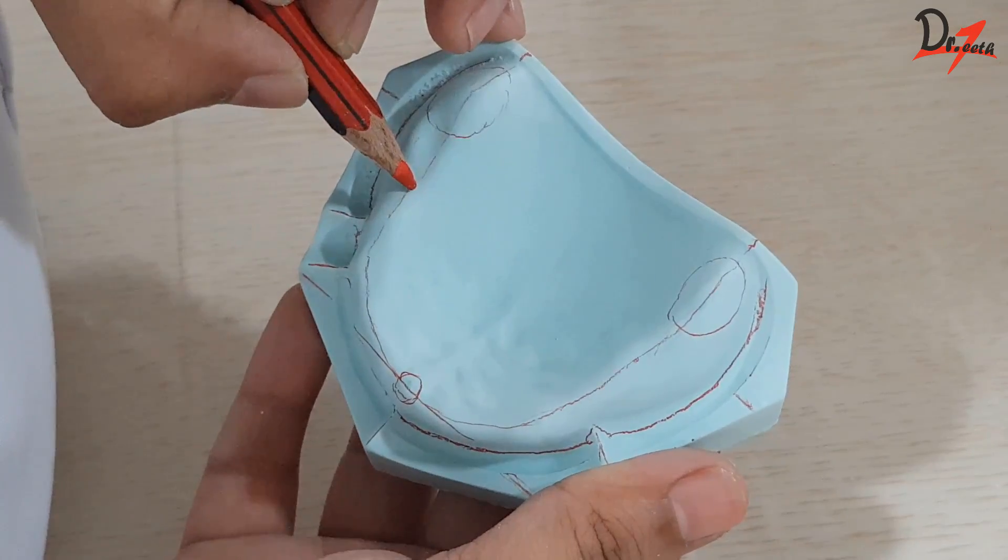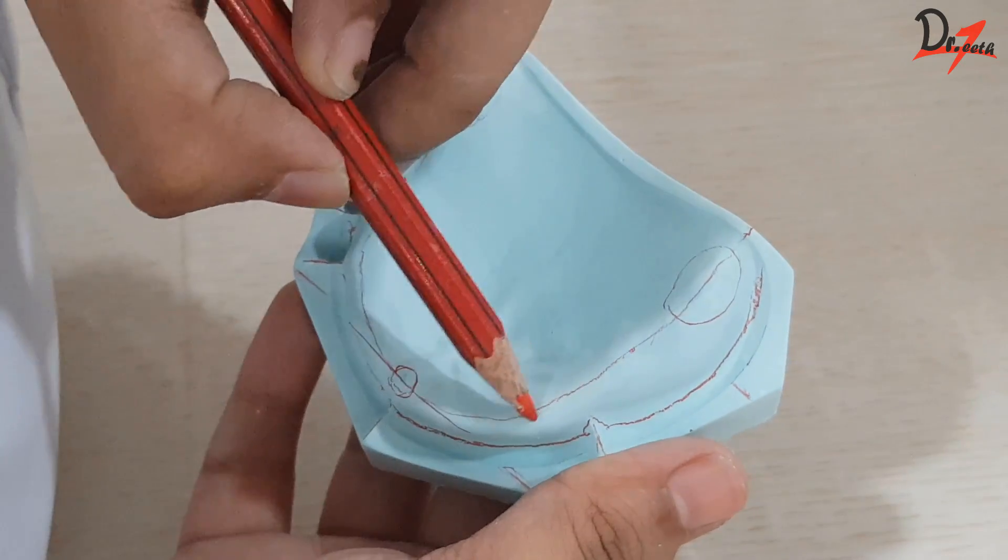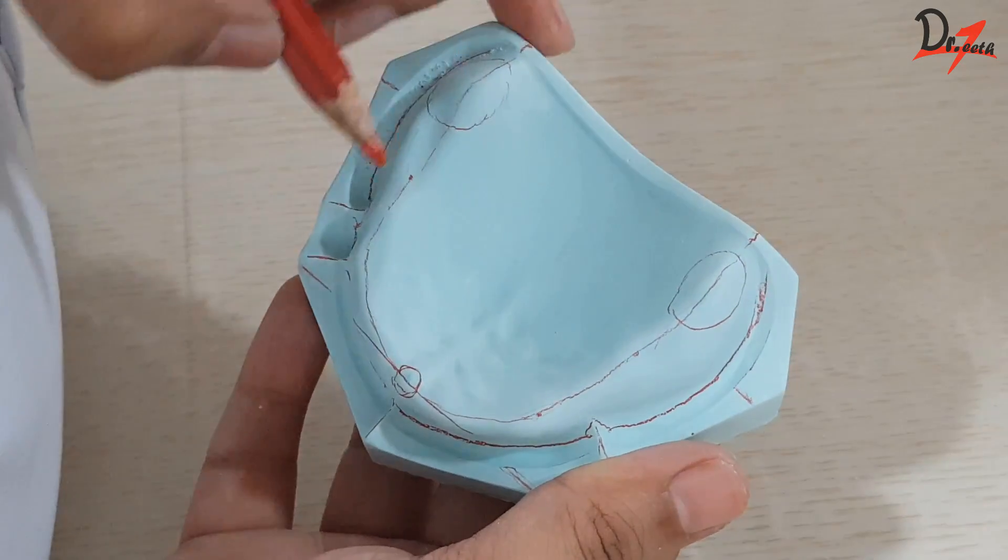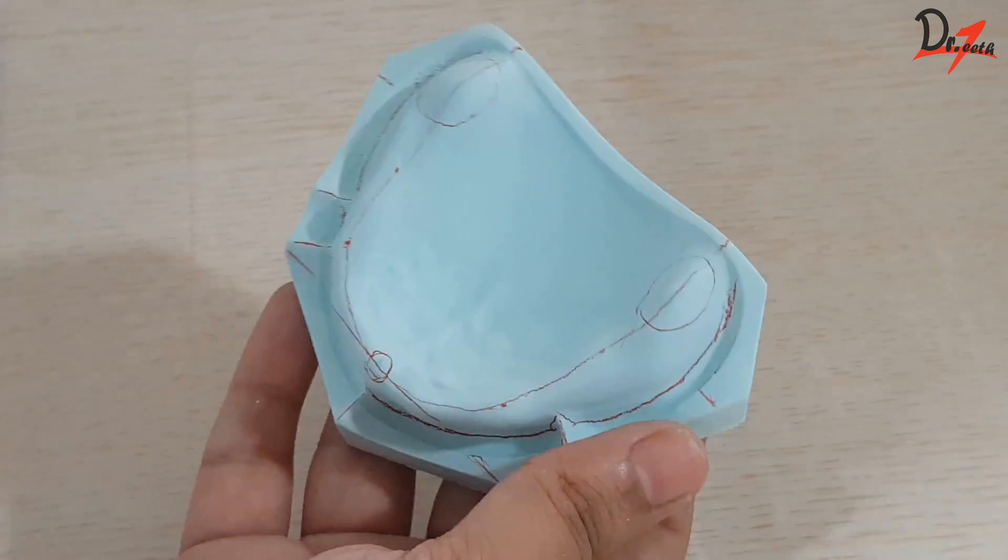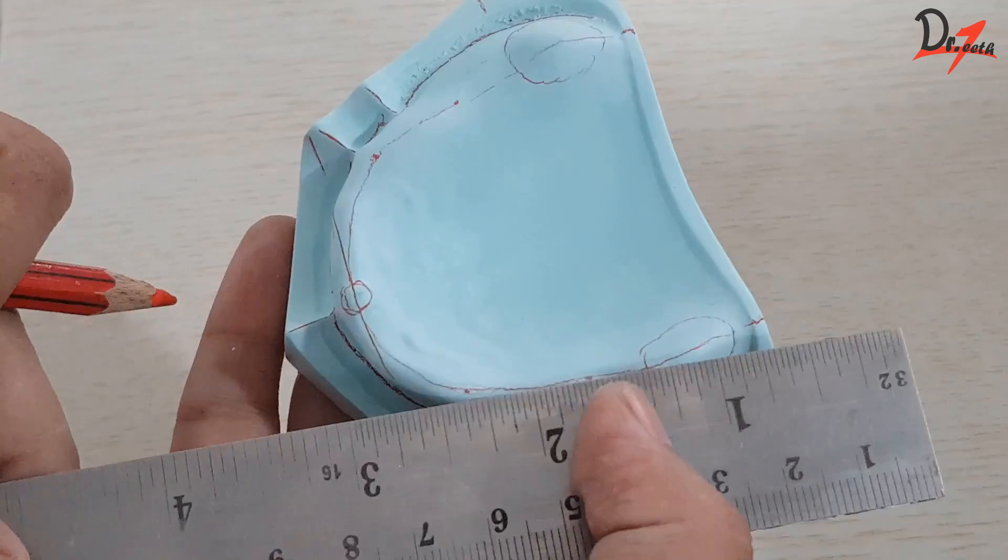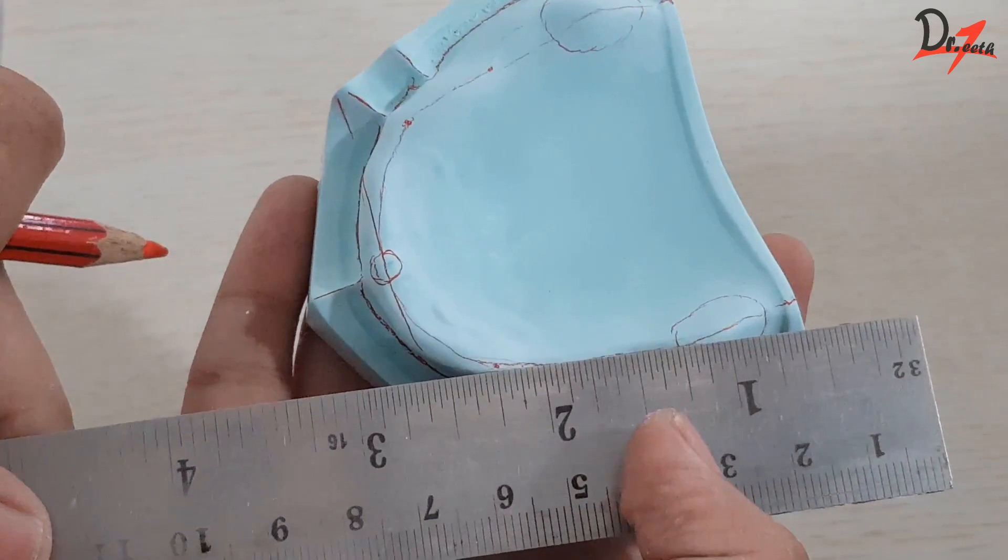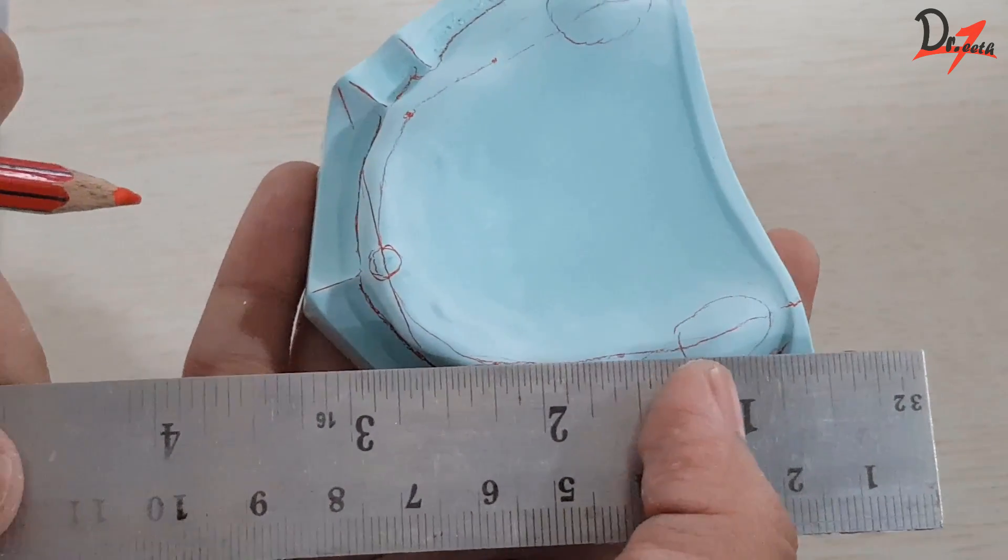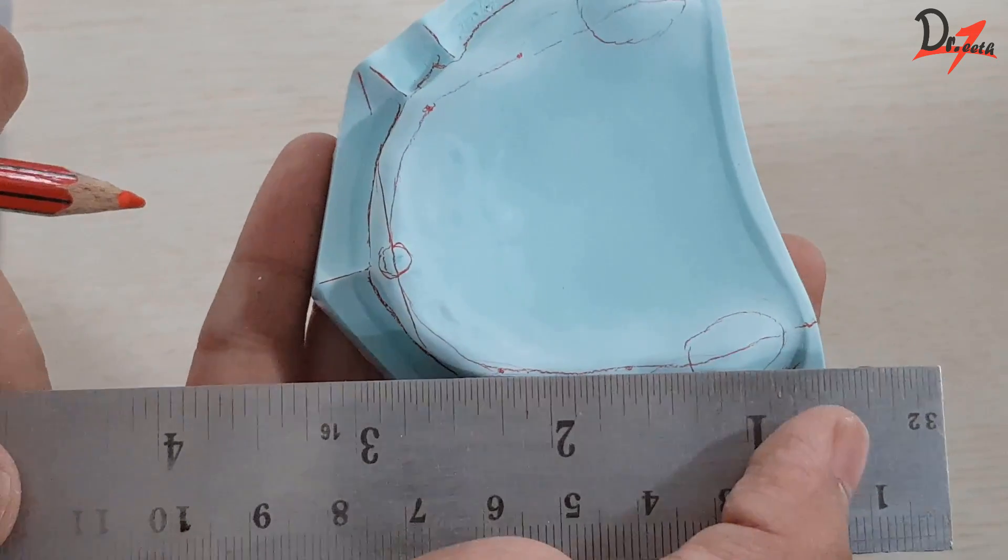So take a point 4mm ahead of the anterior end of the maxillary tuberosity. And from there, the area where this straight line starts to get curved should be the other point. Now we got a straight line.